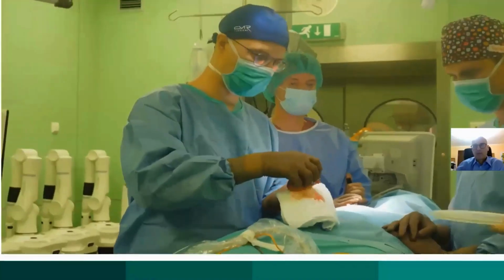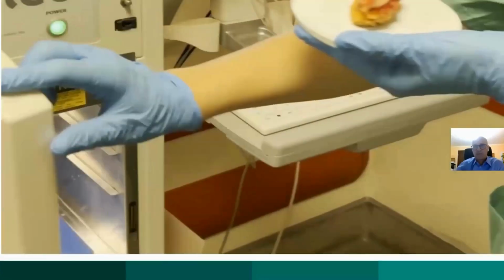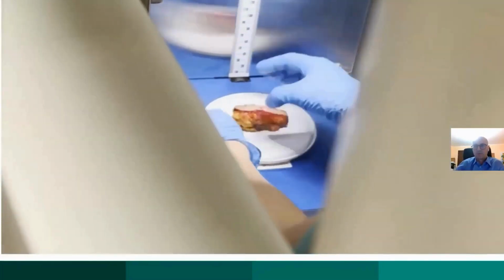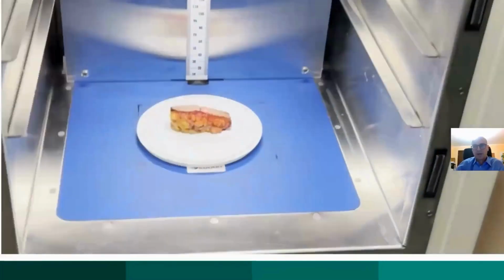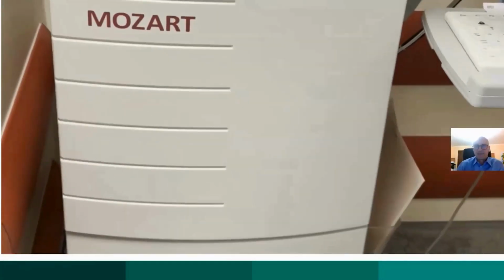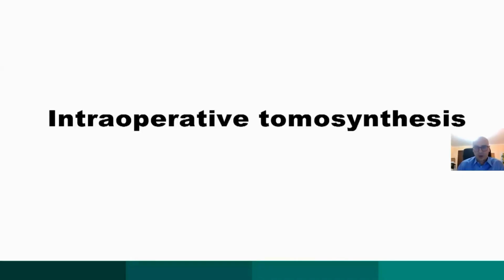Then the specimen is placed into the tomosynthesis apparatus. Well, it takes a while, but it's much shorter than running to the first floor. So then the intraoperative tomosynthesis pictures are taken.